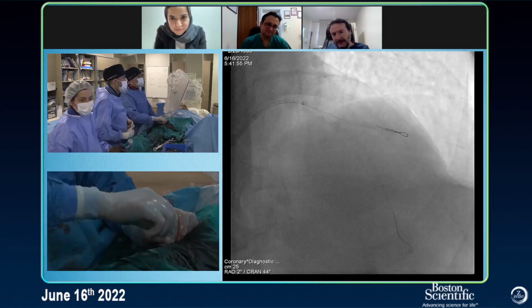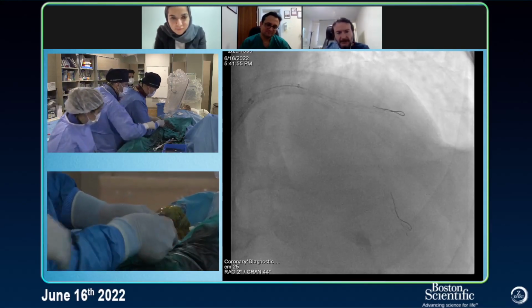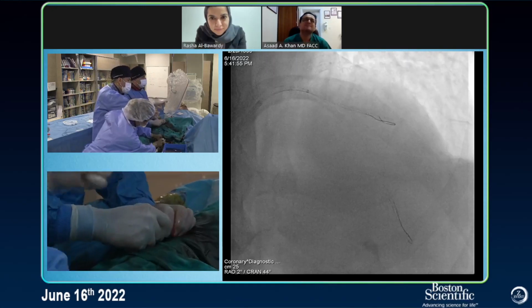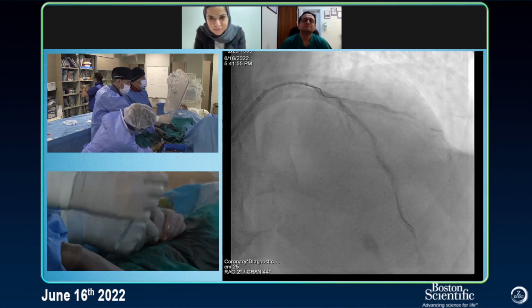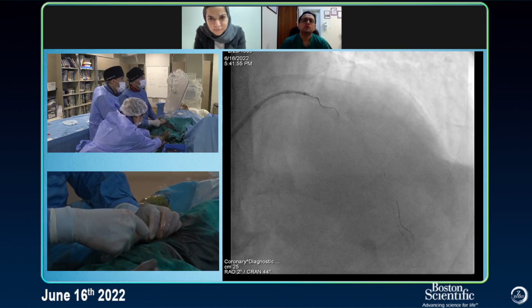All right. So what I want to do, I'll remove this diagonal, and I'd like to cross it with this wire. So I hope I can do it, inshallah, and then I'll have a nice way to go down. Torque, please.